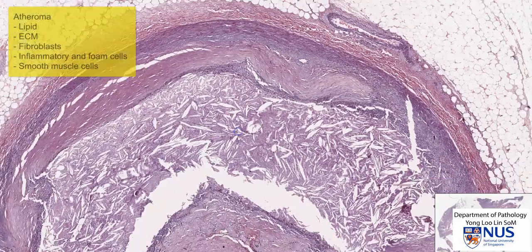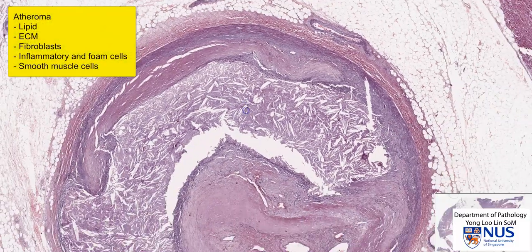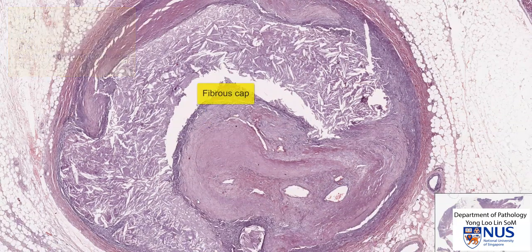This plaque is composed of a central lipid core, and around it we have a lot of extracellular matrix material — proteoglycans, collagen, elastin — as well as fibroblasts, some inflammatory cells, and smooth muscle cells. This is the fibrous cap.